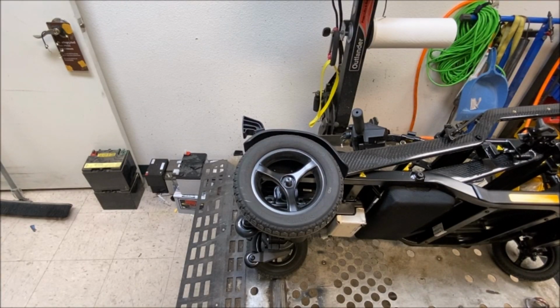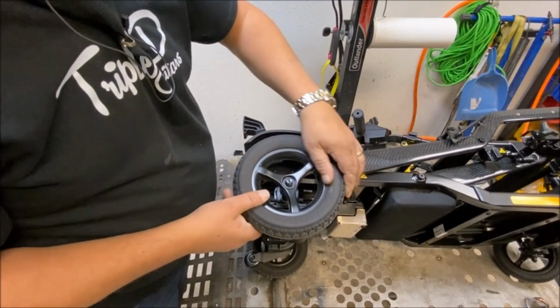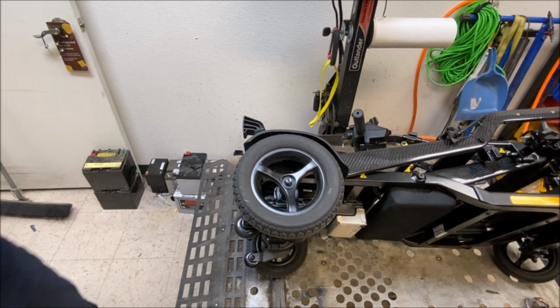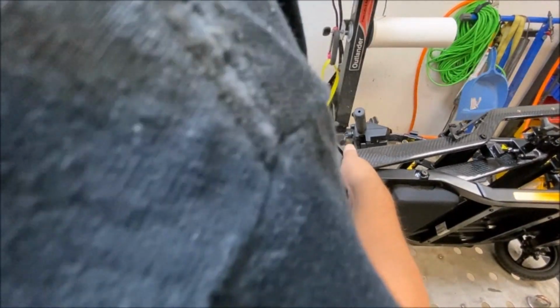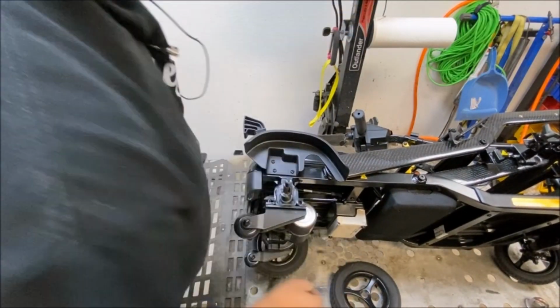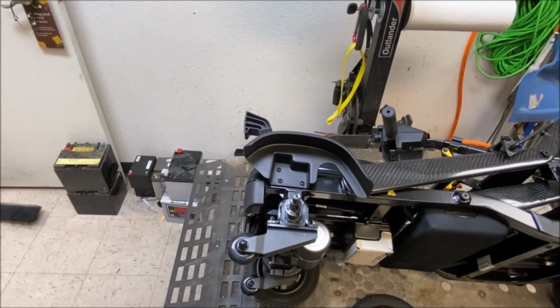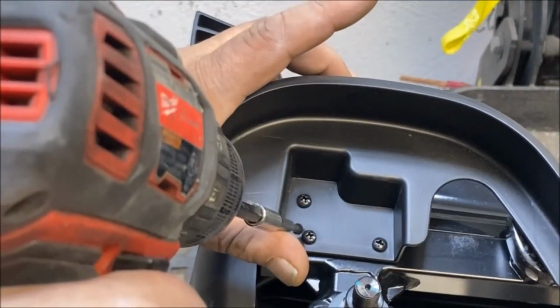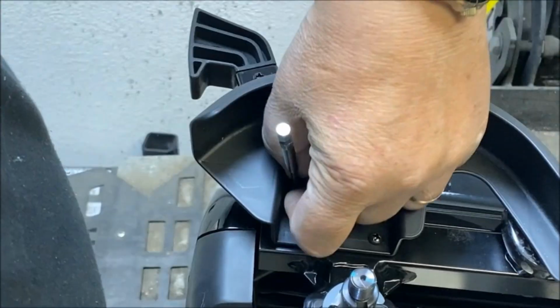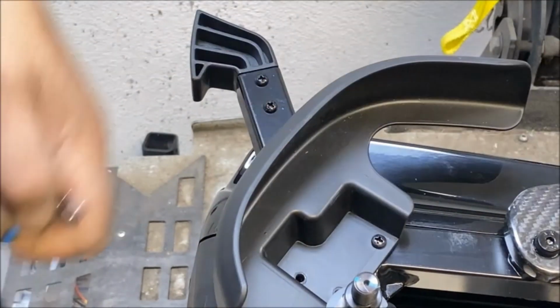And then I can get access to the, oh jeez, just in case that's holding it in. Get that out of the way. Okay. They're on tight. You can see the 3 screws behind the fender liner. There we go, 3 screws there. That's just so we can get into that bolt that's behind there. I'm hoping I'll leave the last one in and just tilt that out of the way.